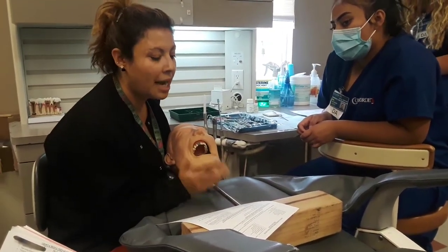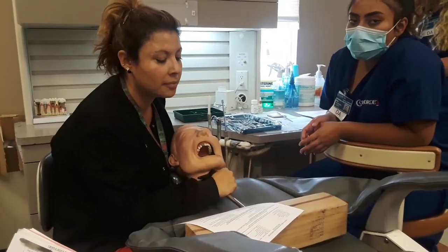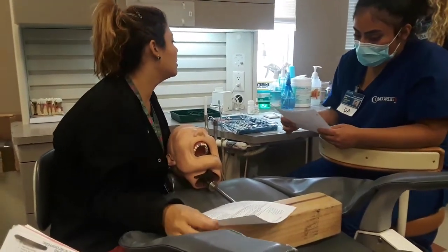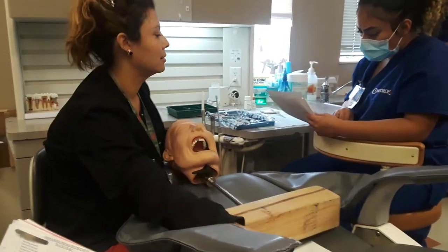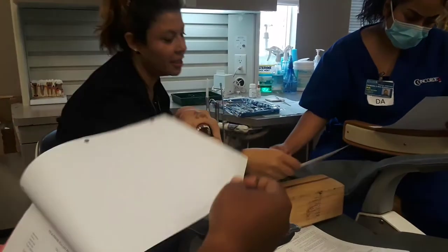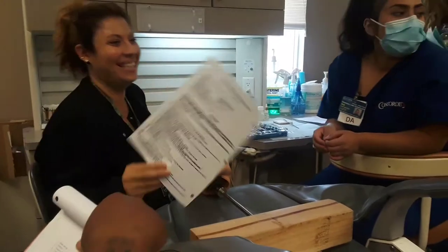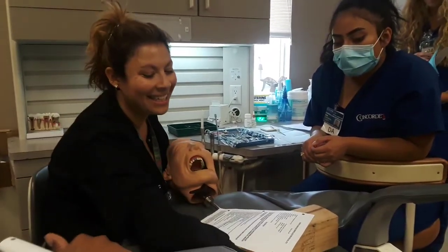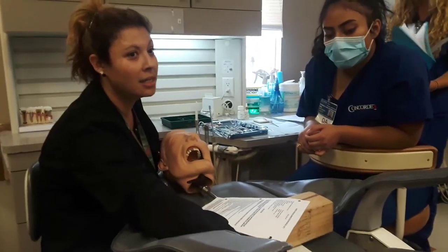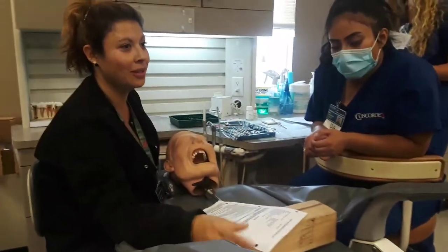Diamond bur — that's for occlusal adjustment. Cord packing instrument. Wait — this is prep. A cord packer is only for prep because we need to pack the cord around the sulcus for the final impression. That's how I knew which procedure we were off on.